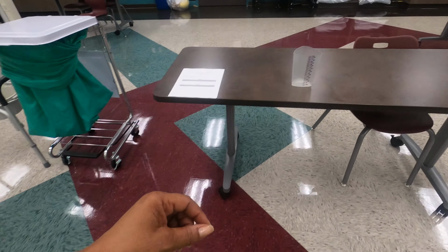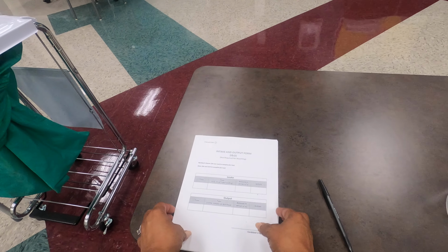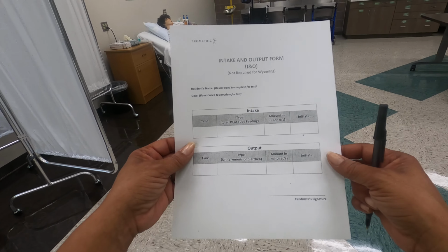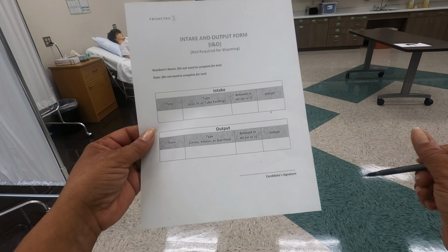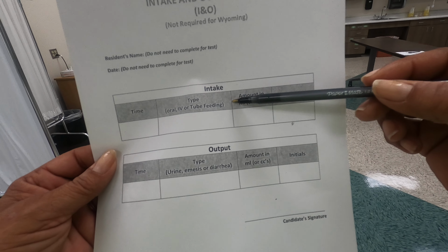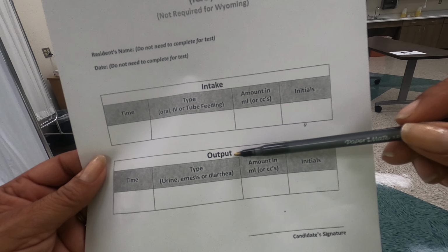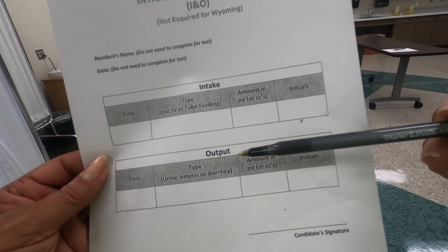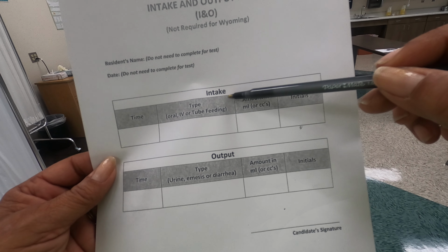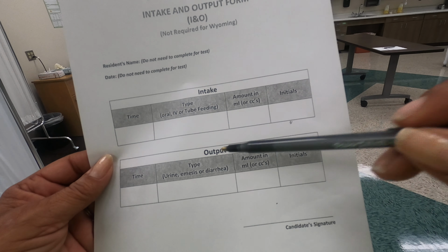Go back to the table, and now it's time to record the urine measurement, okay? So I just want to show you the measuring form that PROMETRIC uses for intake and output, okay, the I&O form. You're going to have two tables. The top table is intake. I'm gonna bring it a little closer to the camera so you can see. And the second table is output. You'll want to make sure when you record your measurement, you record on the output table. If you record on the intake table, guys, you're gonna fail the skill, okay? So make sure you record on the output table.